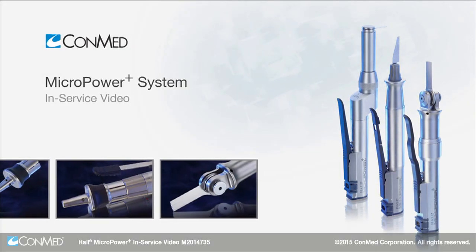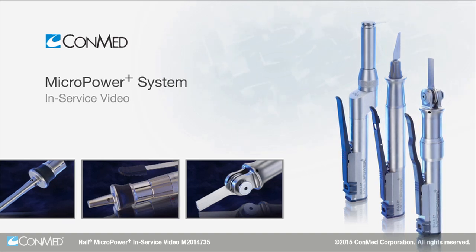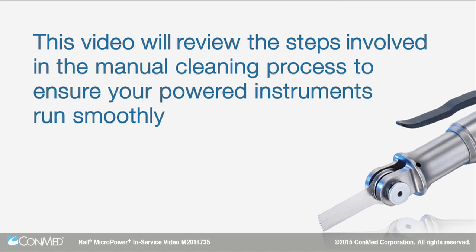The Hall MicroPower Plus System is the most recent innovation in small bone orthopedic powered instruments from ConMed. This video will review the steps involved in the manual cleaning process to ensure your powered instruments run smoothly.